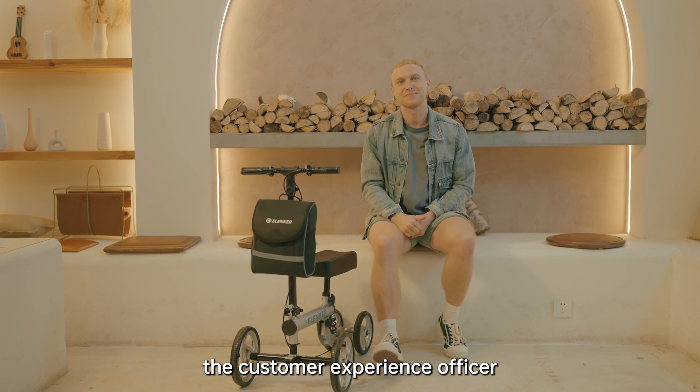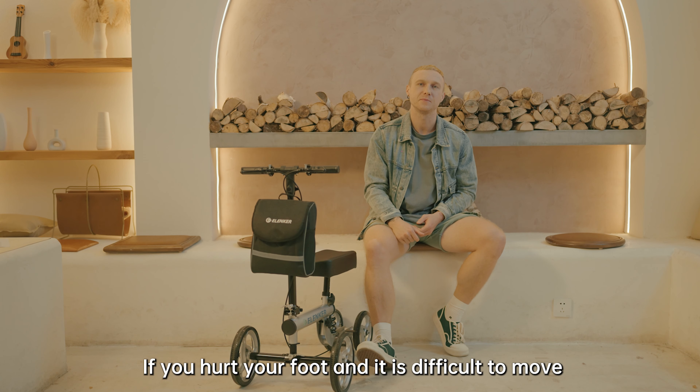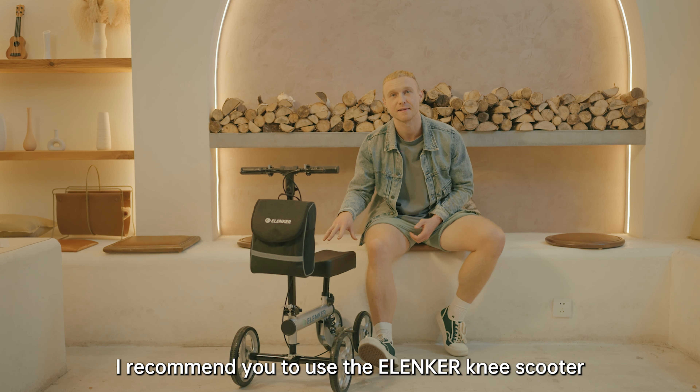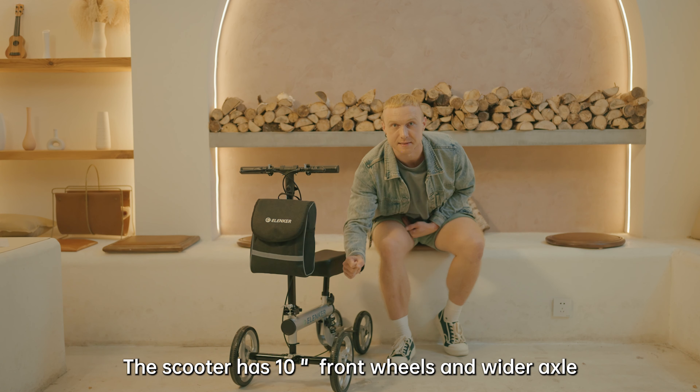Hello, I'm Felix, the customer experience officer. If you hurt your foot and it's difficult to move during the recovery period, I recommend you to use the Elencar knee scooter. The scooter has 10-inch wheels and wider axles so that you can feel more stable and safe when using it.